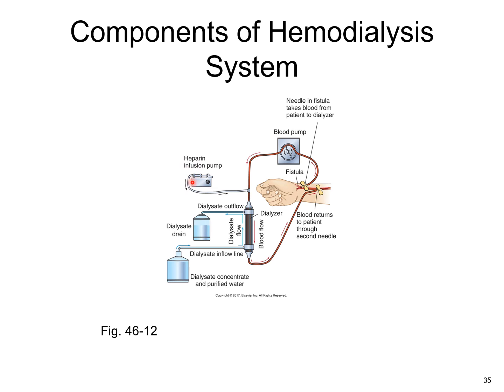So you have other components that are bringing in heparin. You have this piece here, the dialysate coming in from the bottom. So blood coming in from the top, dialysate coming in from the bottom, and then the semi-permeable membrane doing its thing, and then blood going back to the patient.